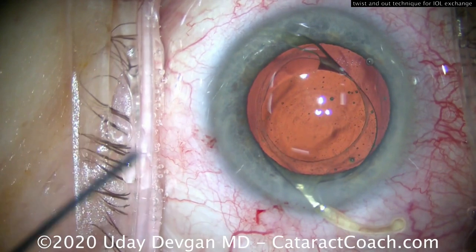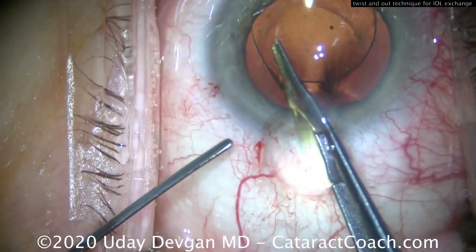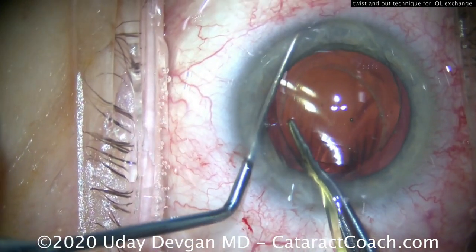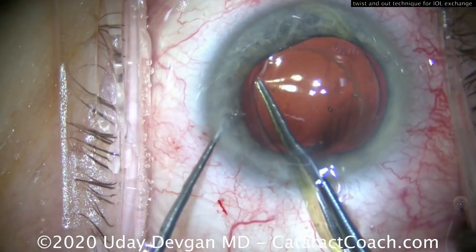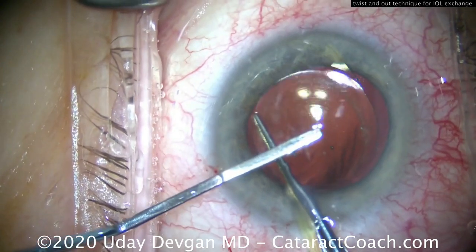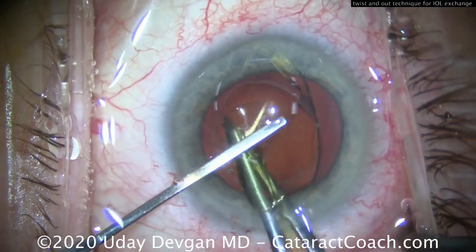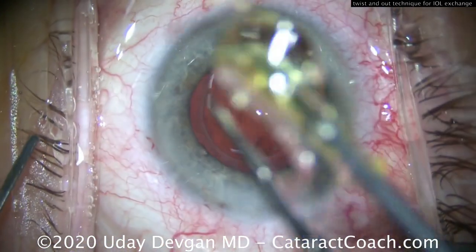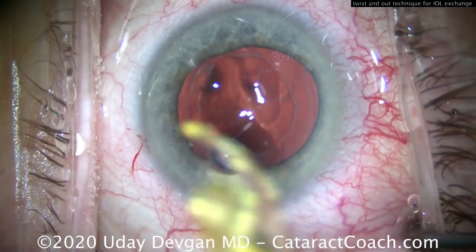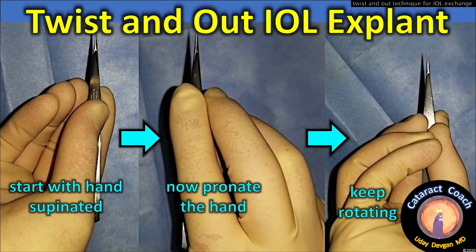There are other methods as well. The twist-and-out technique has been previously published and featured on cataract coaching. This involves grabbing the edge of the optic with straight tying forceps and using a chopper to get a really good grip, with one haptic outside the eye. A spatula helps protect the corneal endothelium and assists in rolling up the lens, allowing it to be pulled out through an unenlarged incision as small as 2.4 millimeters — no extra cartridge needed. This is the paper we published with Rahul Pundit and Jack Chapman, who taught us this.